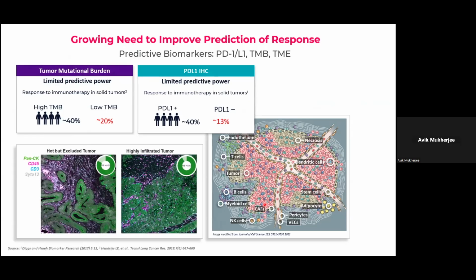For example, if you look at these 2 tissues, you grind them up and look at the tumor infiltrating scores, they don't look too much different, as you can see here. But if you look at these 2 images, there is a difference between the image on the left and the image on the right. And that's the power of spatial biology. When you image with protein markers, you can really better understand what's exactly happening in your tissue.